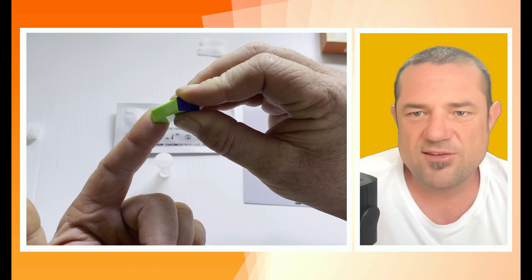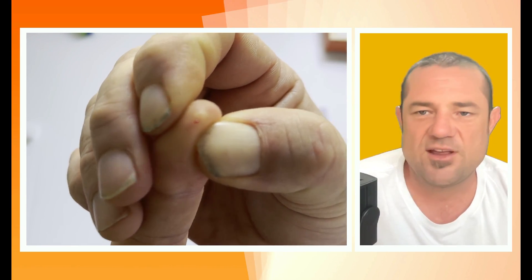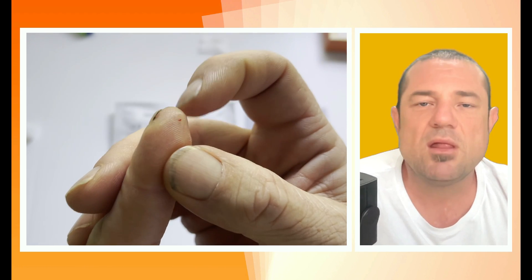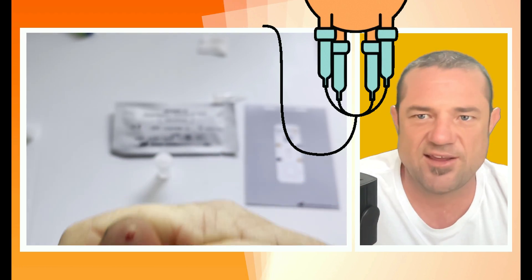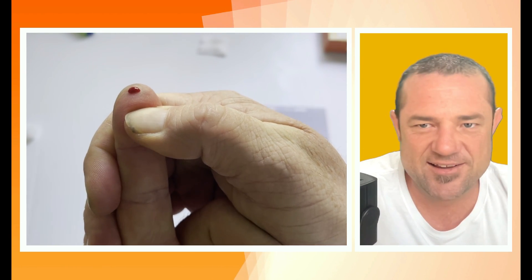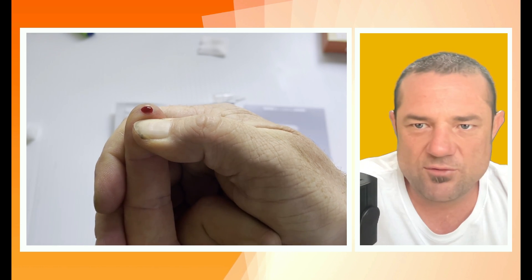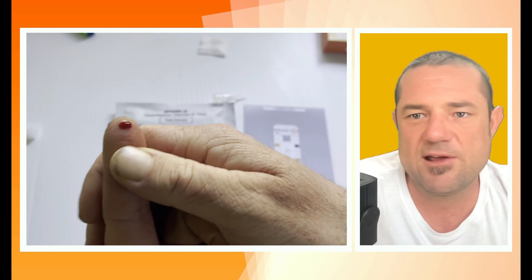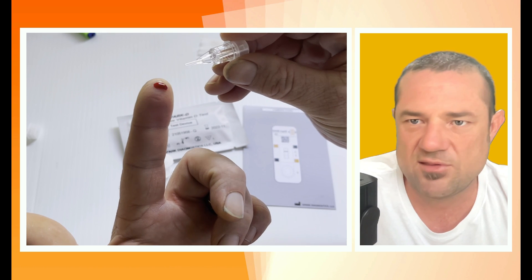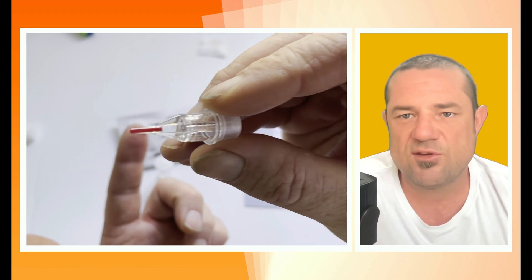What you're going to see here is a dude with some pretty thick blood, so you do need to give your finger a bit of a squeeze. A really good technique is to milk your finger like you were milking Daisy. And there you go — that pulls pretty nicely. Once you've got a good amount of blood on the end of your finger, get that little blood collection tube and just draw it near the blood — it will get sucked up into the tube.